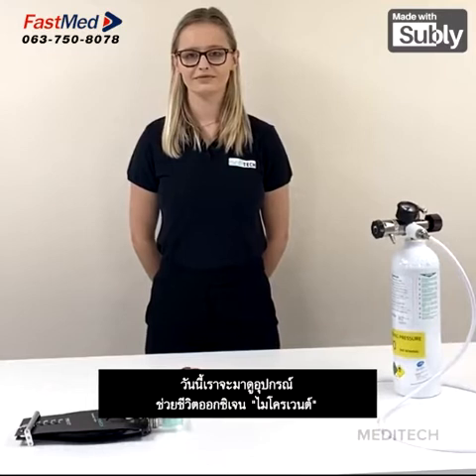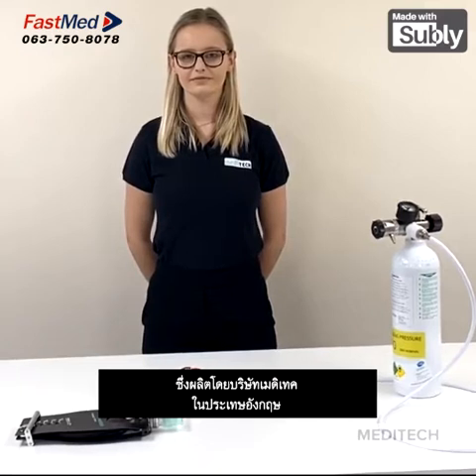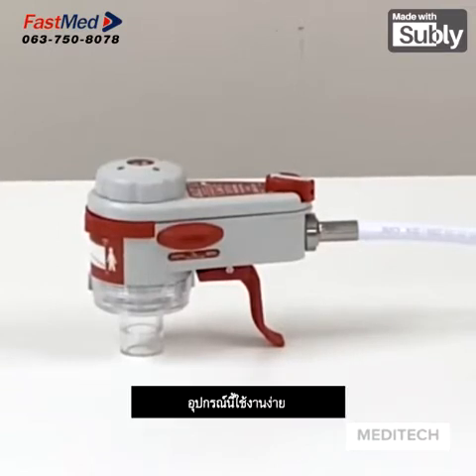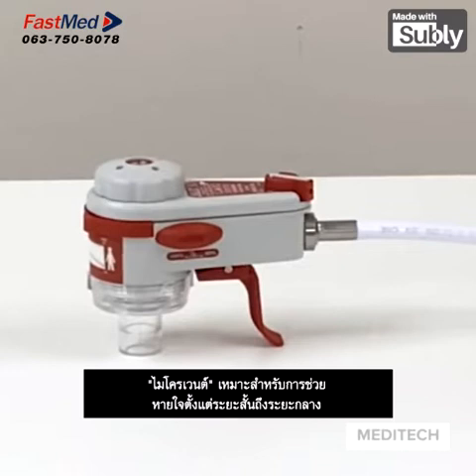Today we are going to be looking at the Microvent oxygen resuscitation device, which is manufactured by Meditech in the United Kingdom. The Microvent is a pneumatic oxygen powered resuscitator suitable for adults and children over 10 kilograms in weight. The device is easy to use, lightweight and very compact. Its dimensions are 120mm x 55mm and it weighs only 250 grams. The Microvent is suitable for short to medium term ventilation periods.